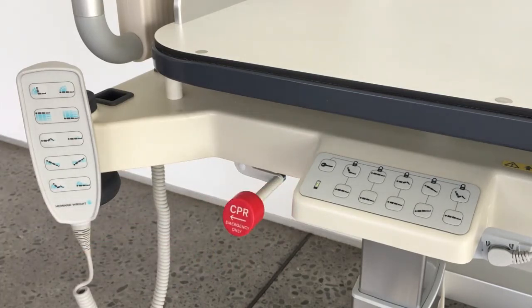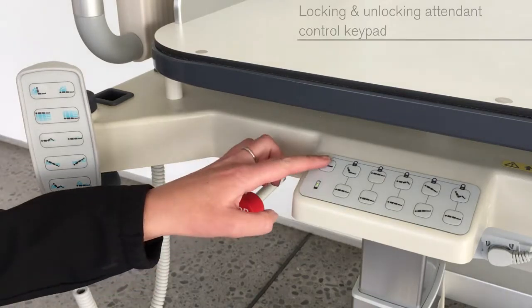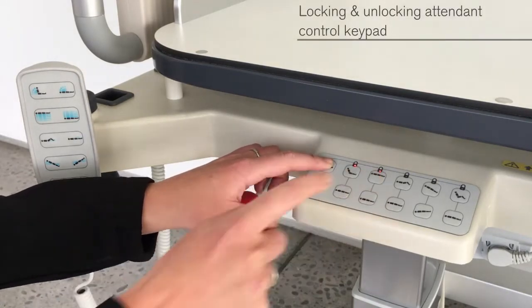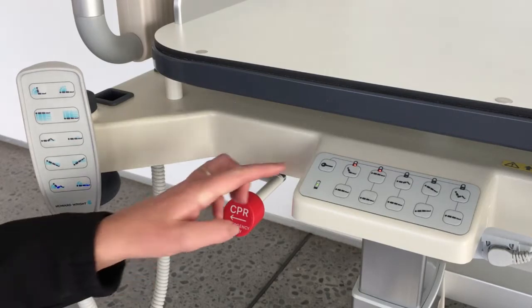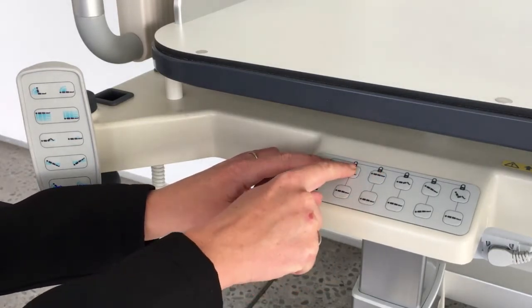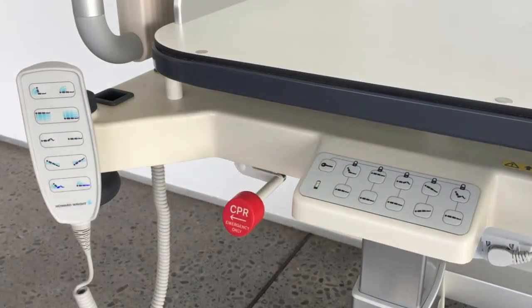To lock out any electric function, press and hold the key button and press the function button. Any function locked out on the attendant control keypad will also be locked out on the handset.